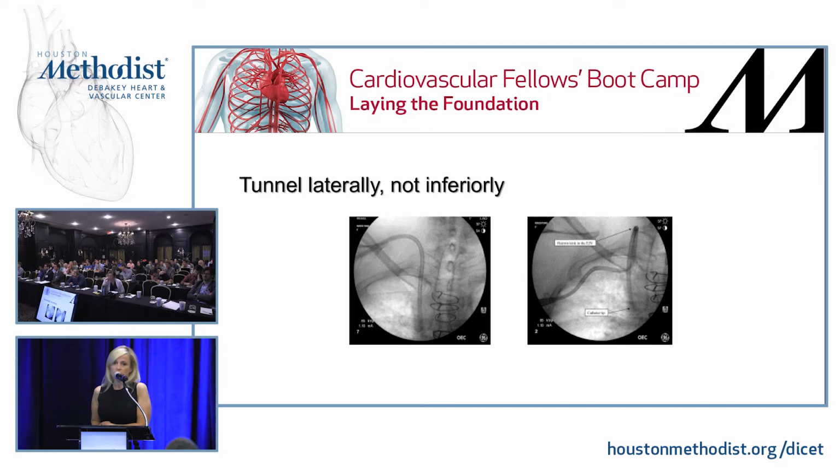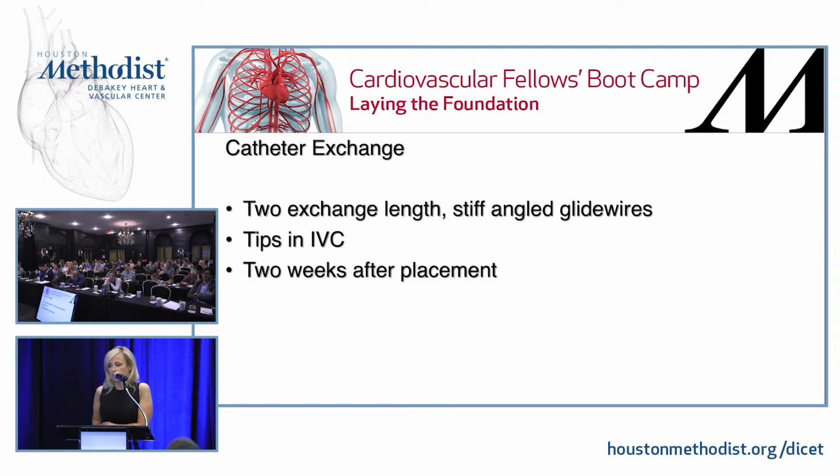Tunnel laterally, not inferiorly, even though this picture here does look bad. In order to really determine whether or not this would be acceptable, you'd have to get an oblique picture, and it may be okay. But you're less likely to have a kink in your catheter if you tunnel laterally and if you come real close to the clavicle when you first access that vein.